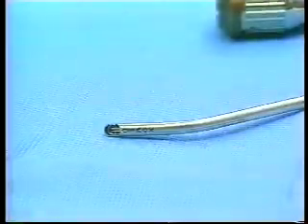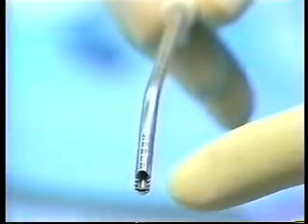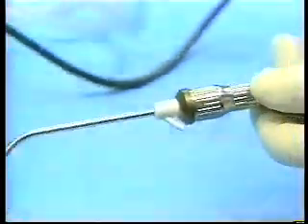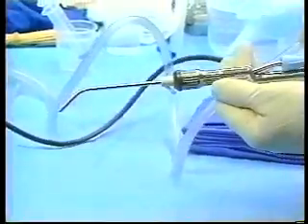In hopes of preventing postoperative velopharyngeal insufficiency, we routinely perform partial adenoidectomy. The microresector blade consists of an outer window surrounding an inner hollow rotating blade. It's angled at 40 degrees to allow easy introduction into the nasopharynx. The blade is coupled to the handpiece, which is connected to standard continuous suction.